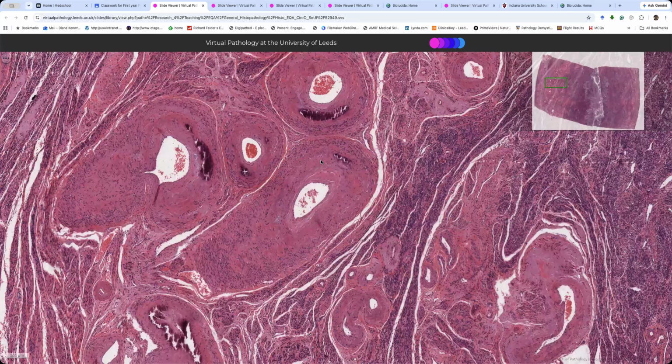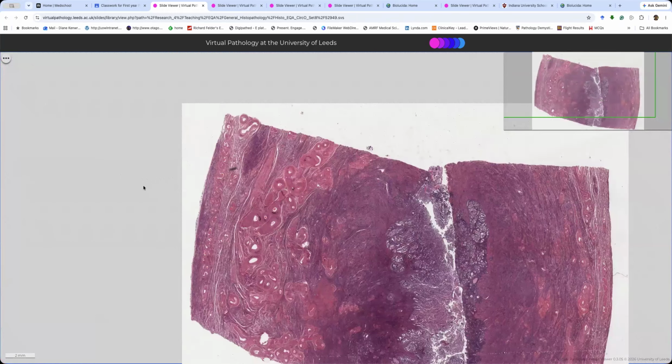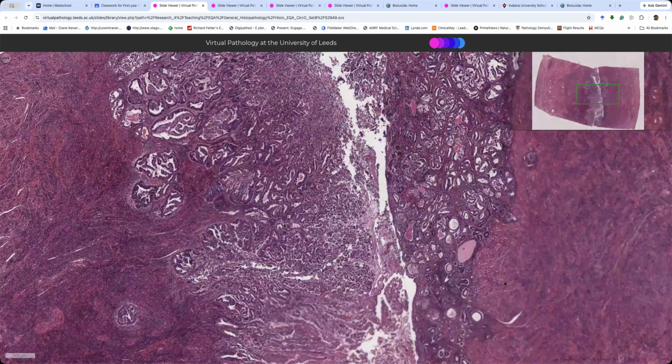Janetta, good thought. Not atrophy, though, as this woman will be postmenopausal. So I'll accept two reasons. Yeah, okay. So she could have generalized arteriosclerosis. Decreased estrogen? No, but she might have been pregnant in the past. Remember how high blood flow injures blood vessels? And the highest blood flow state is pregnancy. So some older people can get calcification in vessels that have been somewhat injured by the high blood flow of pregnancy. Or she could have a systemic disease.